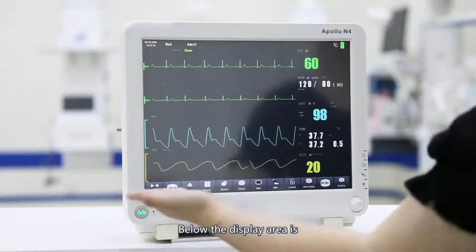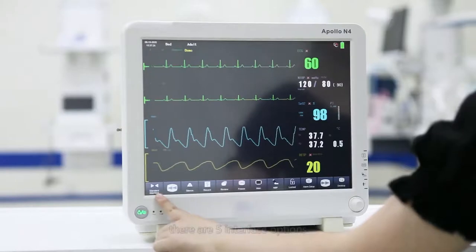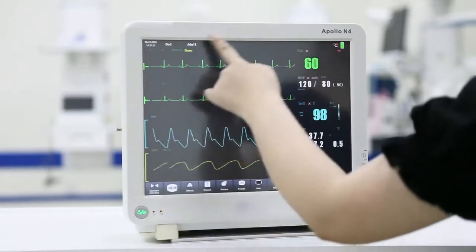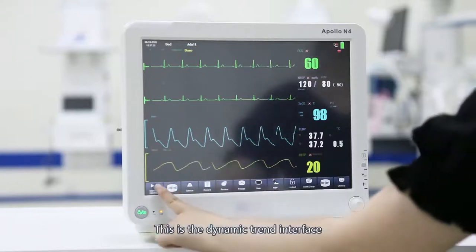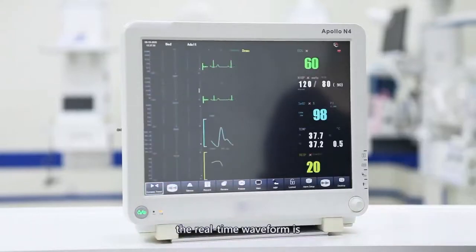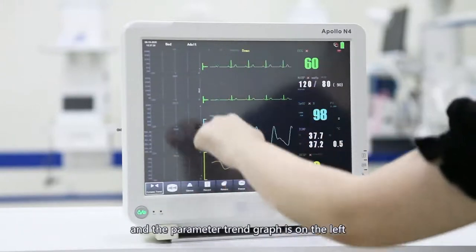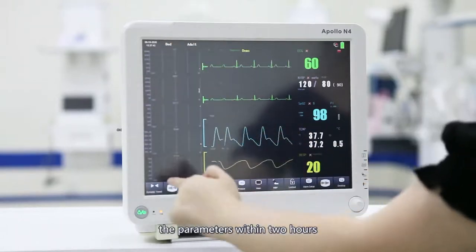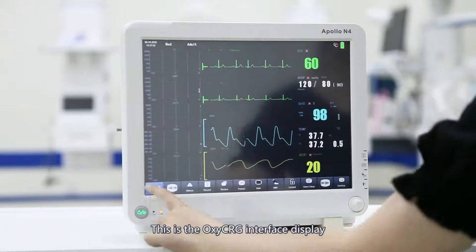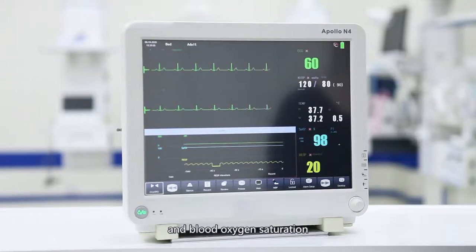Below the display area is our menu setting bar. The first is the interface settings. There are five interface options. Currently shown is the standard display interface. This is the dynamic trend interface; the real-time waveform is in the middle and the parameter trend graph is on the left, allowing you to see trend changes within two hours. This is the OxyRG interface display, which mainly integrates heart rate, respiration rate, and blood oxygen saturation.